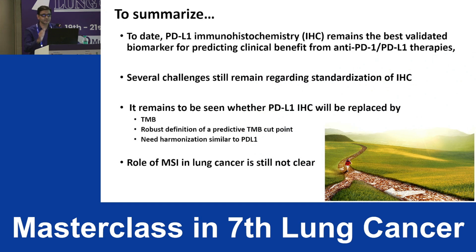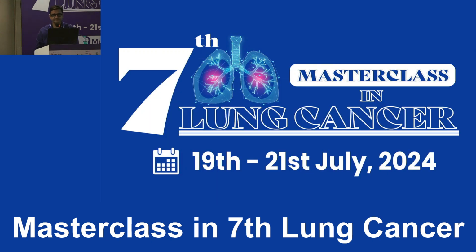So just to summarize, PD-L1 is still the best available validated method, and the role of TMB and other modalities is still under investigation and has a limited role in the decision for immunotherapy. So with this, thanks for your kind attention.